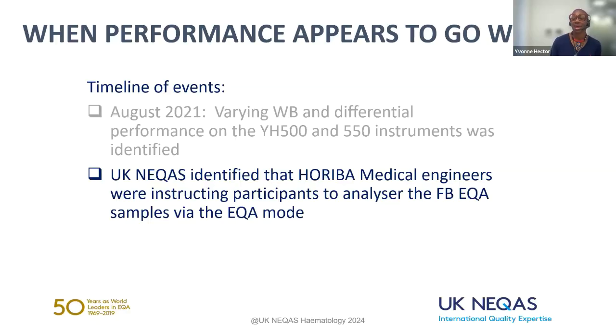So it made sense that they would say to participants, run it through the EQA mode. However, we at UK NEQAS weren't aware of this instruction, and we were providing instructions that were contradictory to what Horiba engineers were telling the participants. So we now had participants returning results via the EQA mode and participants running through the patient mode, as we had been instructing them to.